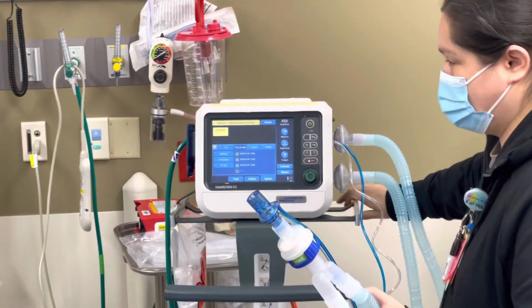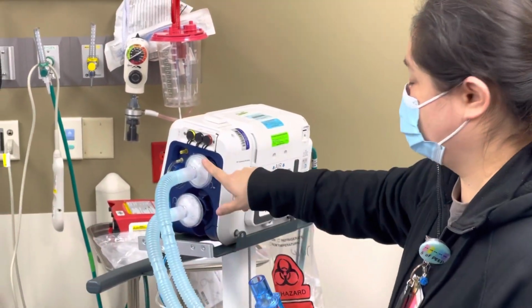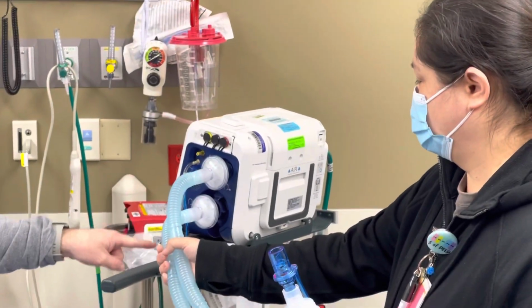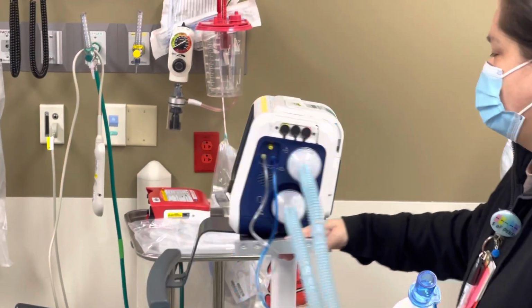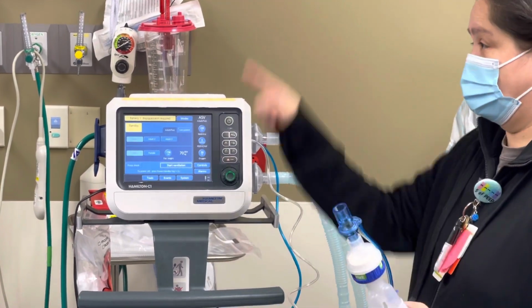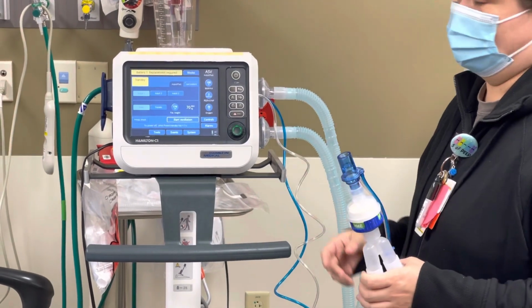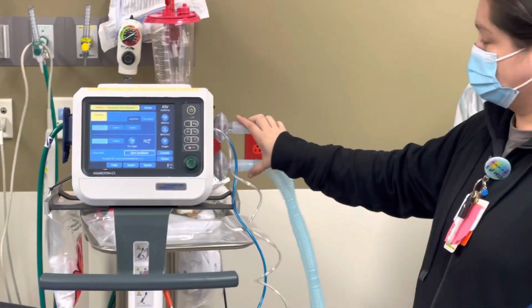Is there any difference between those two? On which one? The blue ones? So this one's gonna be your inspiratory, and this is gonna be your expiratory. Would it matter if we hook this tube into that, or that tube into that? No, no, no, because it basically goes to the... Yeah, that's what I was saying. The only time you're gonna have an issue is if you were having a heater that's actually connected, because then you need to make sure you have inspiratory going all the way through, or your inspiratory will go straight to your expiratory, and that won't work. But on this one, as long as it's connected just like this, you're good.